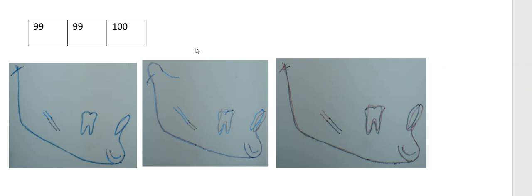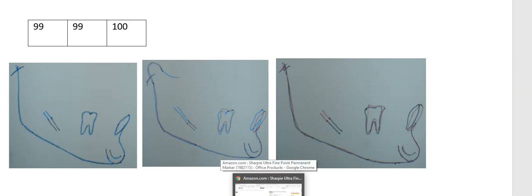Hello everyone. In this presentation, I will give you some exam tips on how to make a mandibular structural superimposition, and I will tell you how the examiners correlate your superimposition with your cephalometric values and your treatment mechanics.